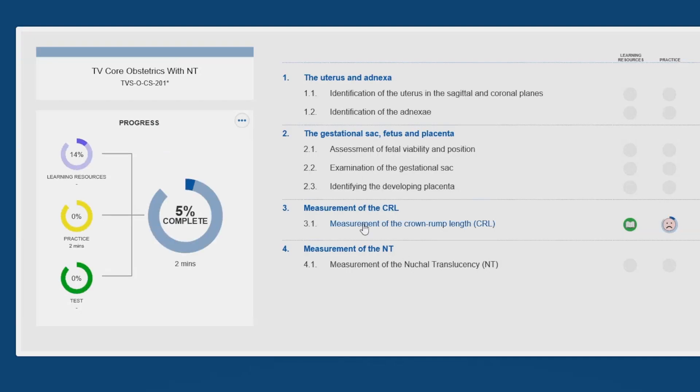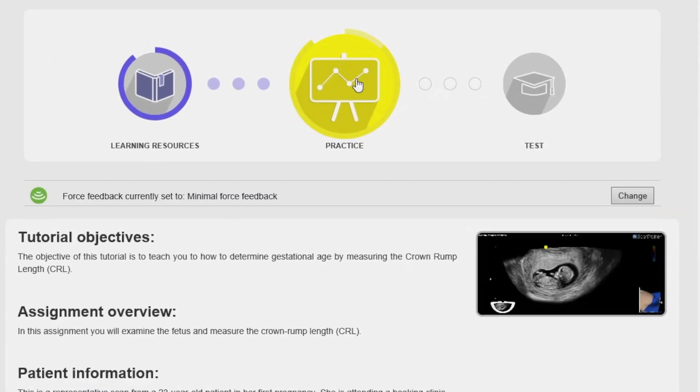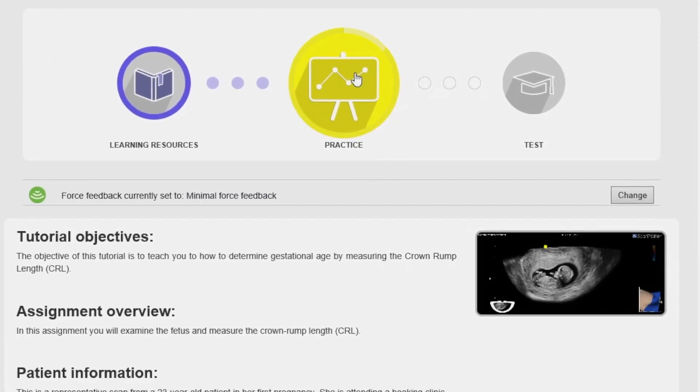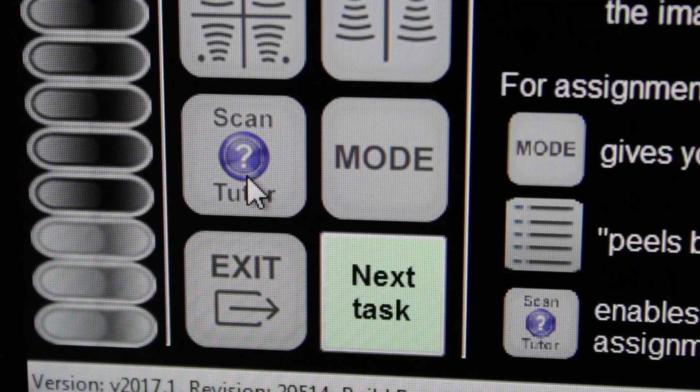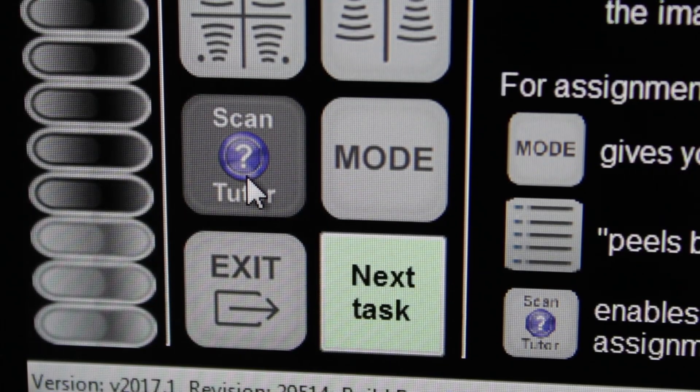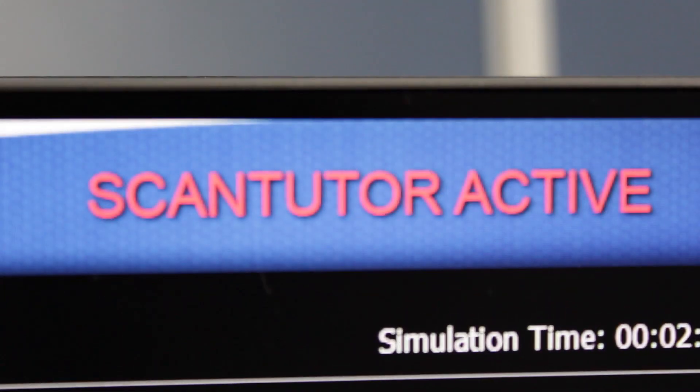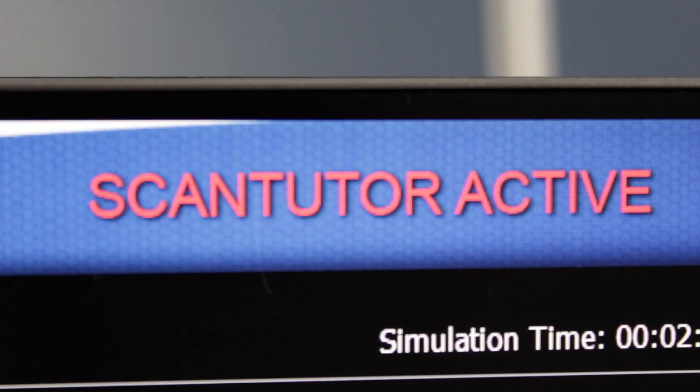ScanTrainer Compact offers an extensive range of core and advanced educational modules. Trainees can work through these modules on their own using our integrated and unique virtual tutor, ScanTutor.